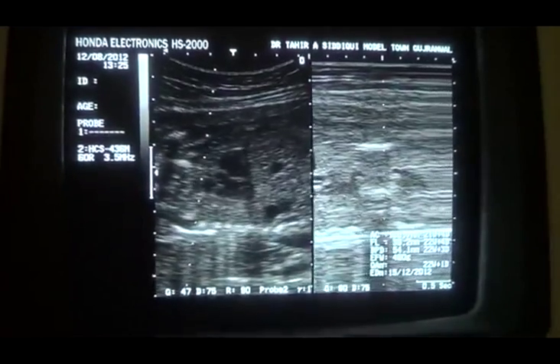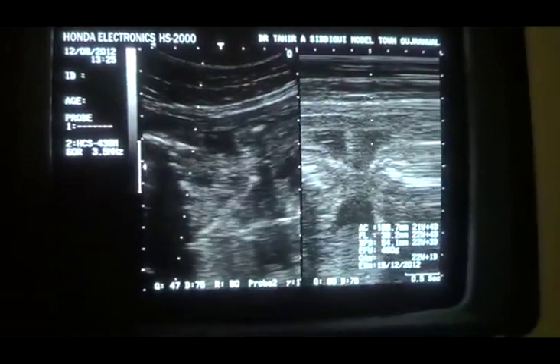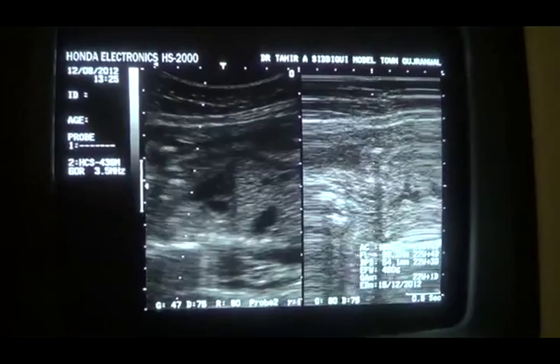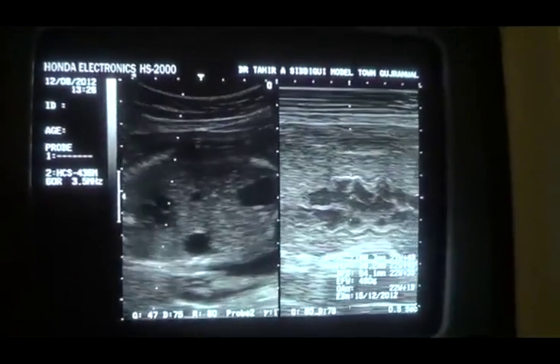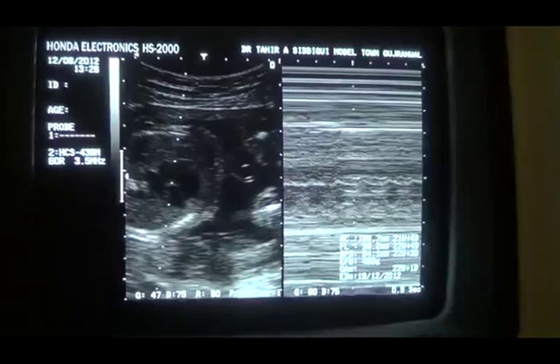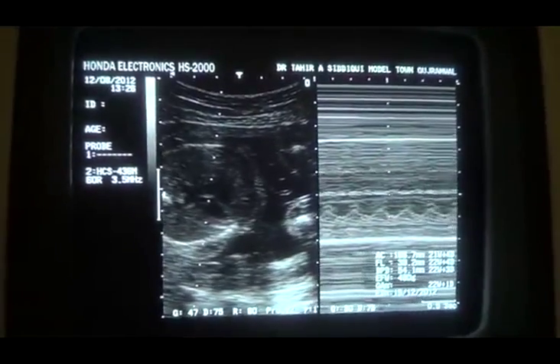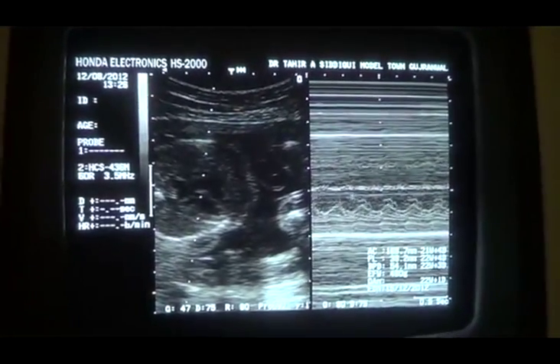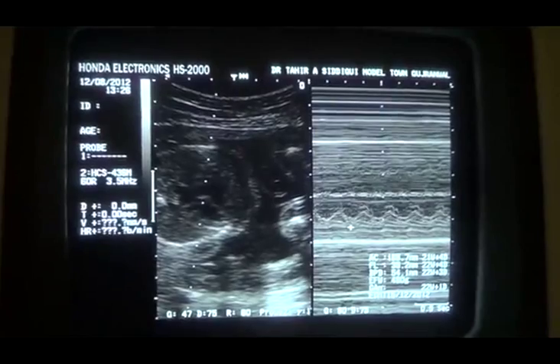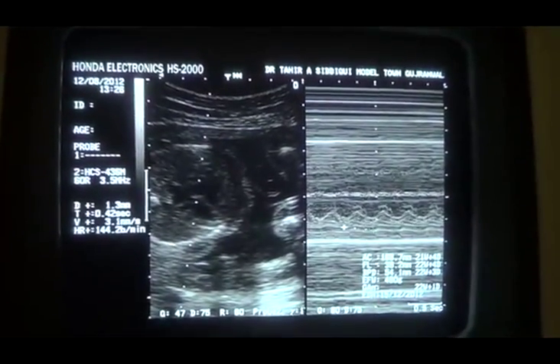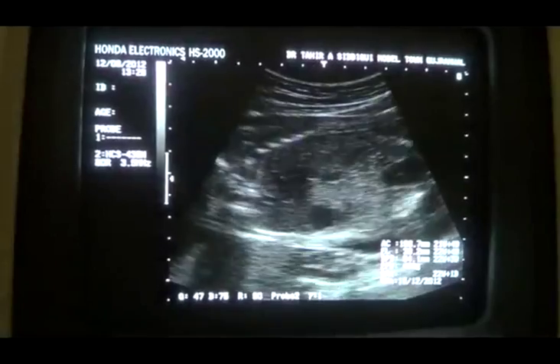We will see the rest of the fetus and then come back to see whether the fetal cardiac activity remains the same or there is any change. This is the four-chamber view of the heart. The mother is tense and so will be the fetus — it will affect the fetus. The beat is now 140 beats per minute, so there is variation which is within normal.